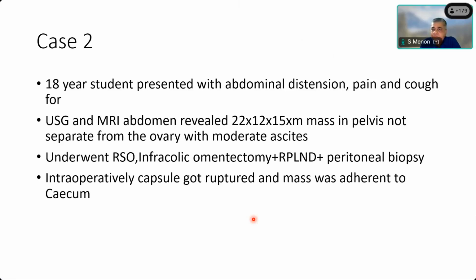So, Renil? Yes, sir. The previous case was a high-grade tumor. High-grade serous cancer, the previous one. Somebody is asking a question online. So, Renil, what do you think an 18-year-old's ovarian mass can be? Sir, it can mainly be a dysgerminoma. Dysgerminoma. So the first slide I showed, which tumor was it, Shweta? Granulosa cell tumor.